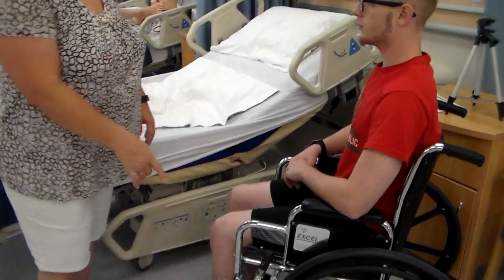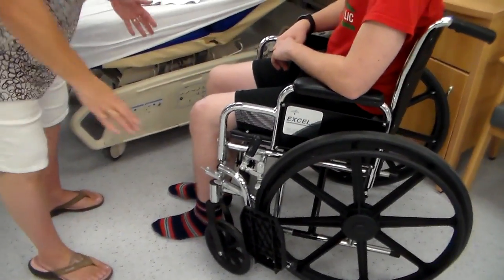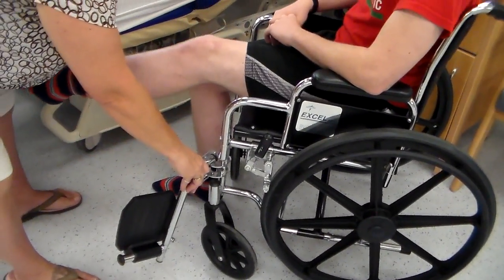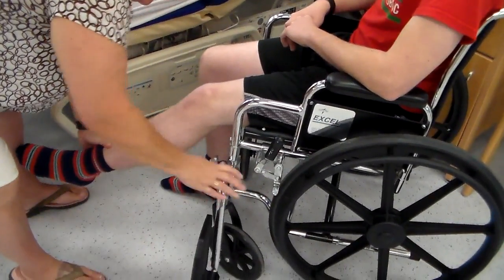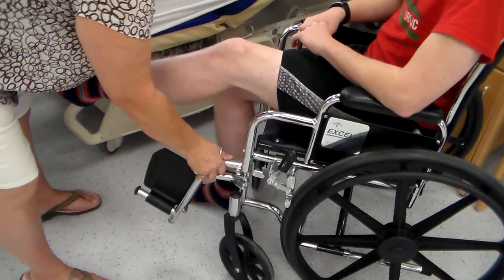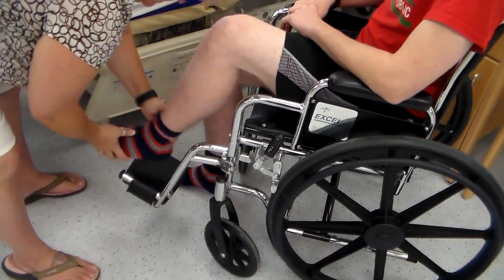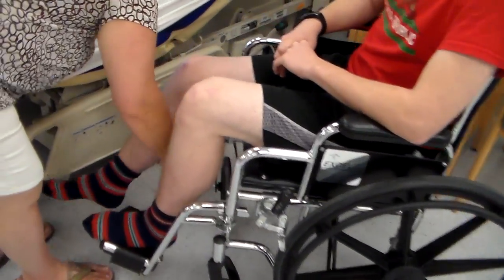Then you're going to take the footrest that we got out of the way so that we had room to move. Okay, you're going to bring them back out front. You're going to bring their leg up because this little thing right here could come and really do some damage to the leg. So you lift the leg, you put the leg in, foot pedal down, and the leg on. Okay? You do the same for the other side.